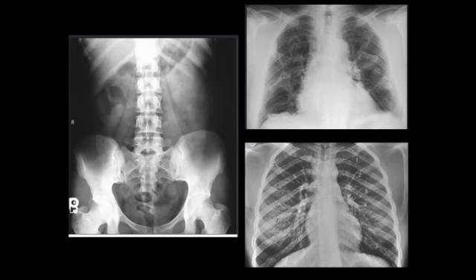It's a PA. But in one, we changed the KVP to help us see the lungs, whereas in the other, we've changed the KVP to help see the ribs. So that's an example of, even though the subject or the patient is the same, just by changing the KVP, we can change our subject contrast.